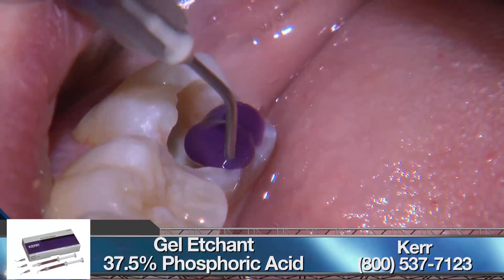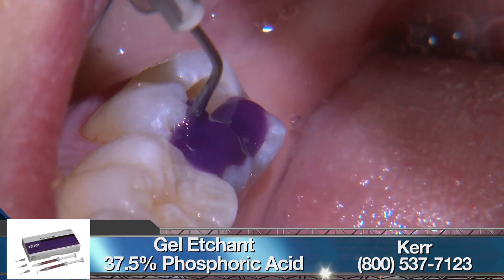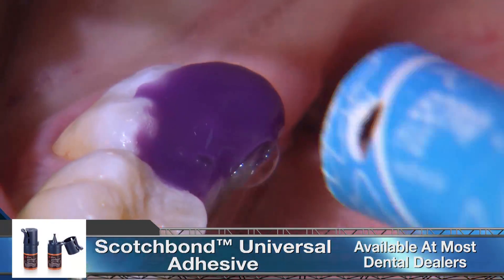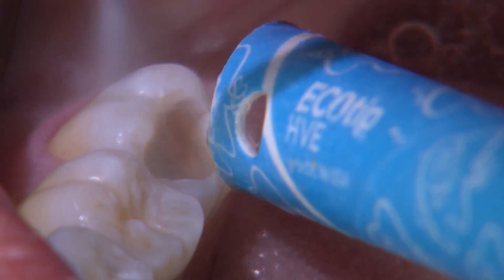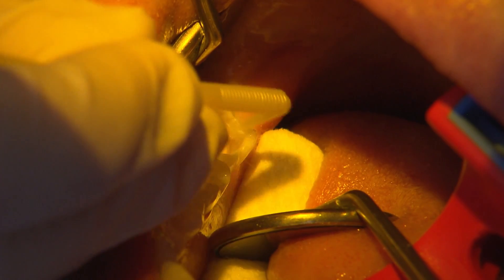We etch with Kerr's 37% phosphoric acid and follow that with an adhesive application using 3M's Scotch Bond Universal. Always use a gentle stream of oil-free air after applying the adhesive until it stops moving. This will ensure that the solvents have fully evaporated and a maximum bond can be achieved.